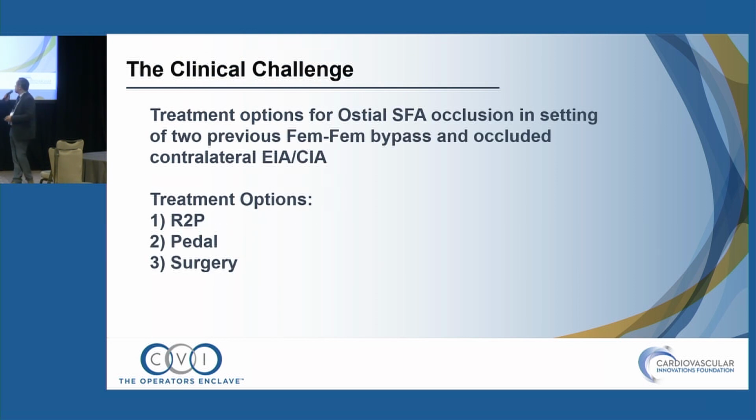So the clinical challenge here is what treatment option we have for this patient. We can send him for surgery to do a distal common femoral and ostial SFA surgical intervention. We can do pedal access, or we can try radial to peripheral.